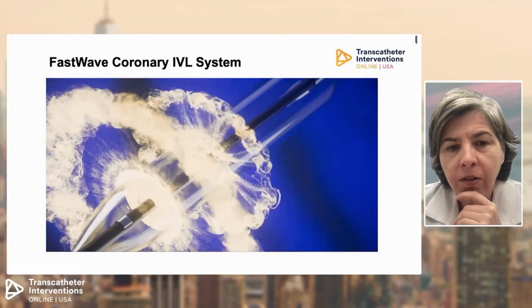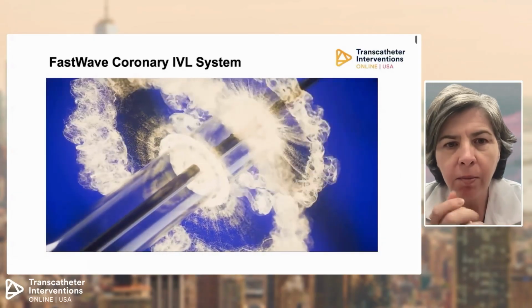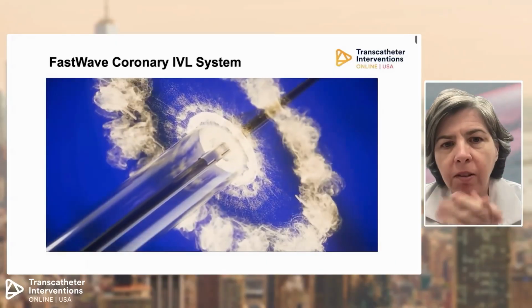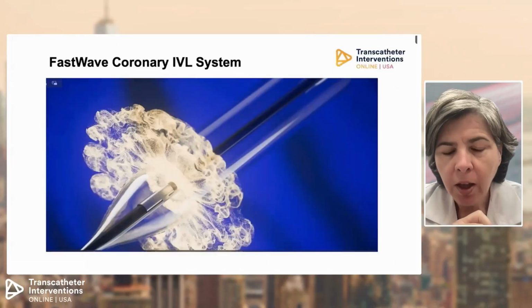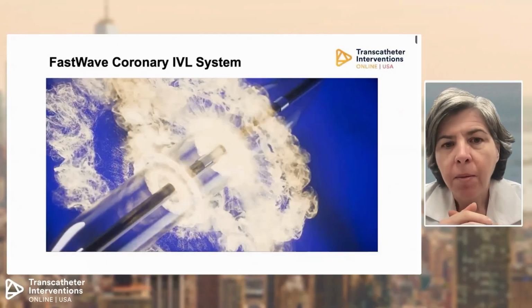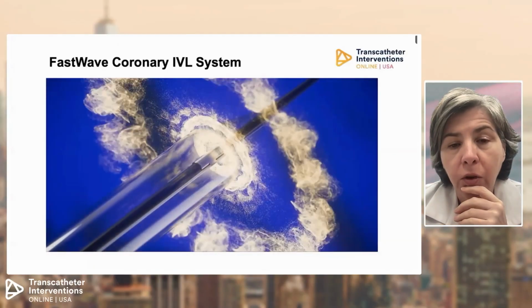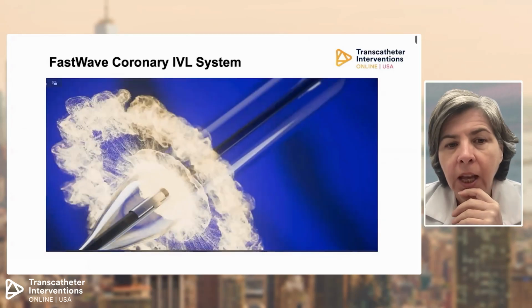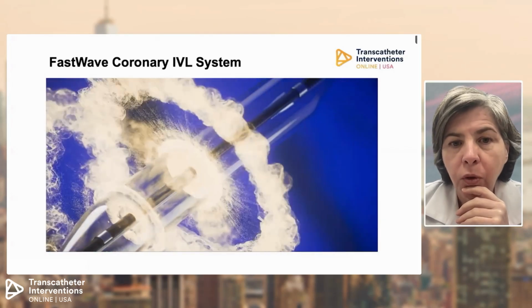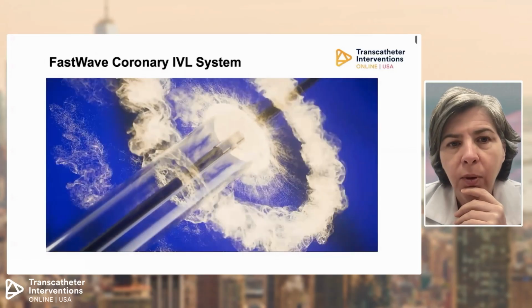A couple other technologies to mention that are on the horizon, the FastWave coronary IVL system. So the focus of this device is to deliver therapy quickly in a 360 circumferential manner. And also there's been a big focus on this device on improved crossability and trackability. It's anticipated that this device will go through its IDE trial commencing later in 2026.